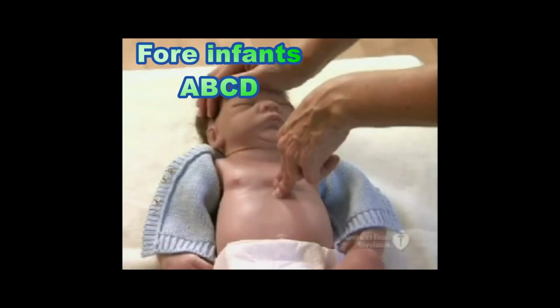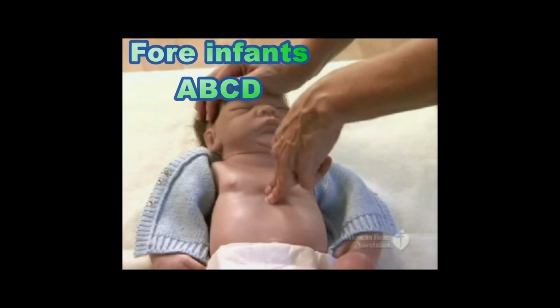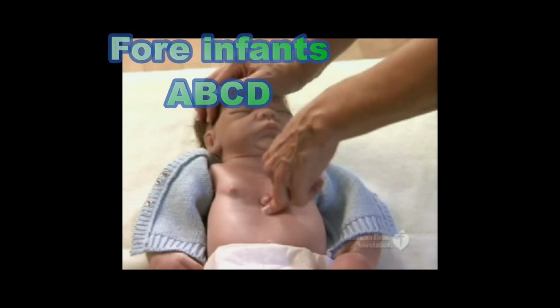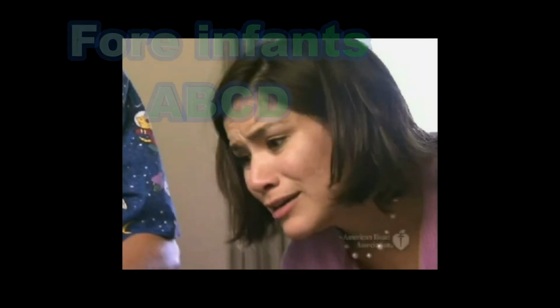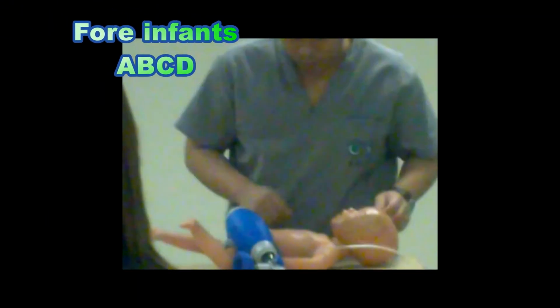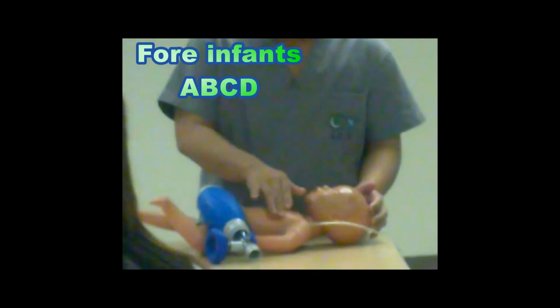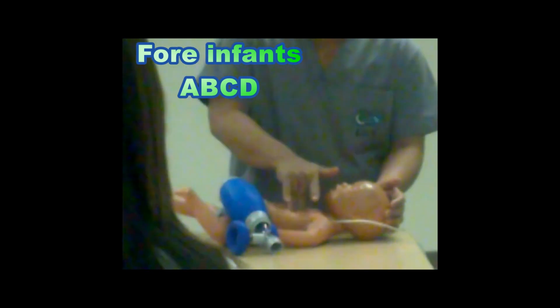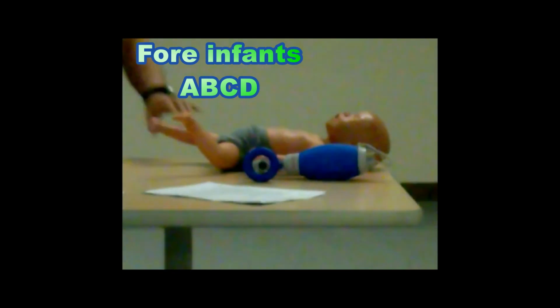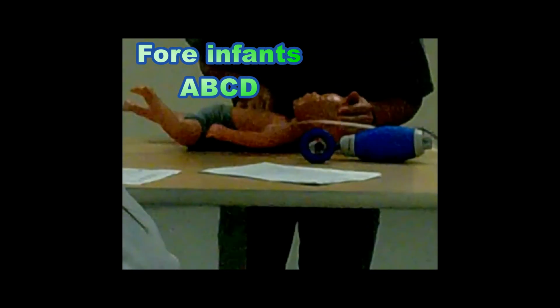2, 3, 4, 5, 6, 7, 8, 9, 10, 11, 12, 13, 14, 15, 16, 17, 18, 19, 20, 21, 22, 23, 24, 25, 26, 27, 28, 20. Help activate code blue spring crash trolley. 1, 2, 3, 4, 5, 6. 1, 2, 3, 4, 5, 6, 7, 8, 9, 10. 1, 2, 3, 4. Baby. Help activate code blue spring crash trolley. 1, 2, 3, 4, 5, 6, 7, 8, 9, 10.